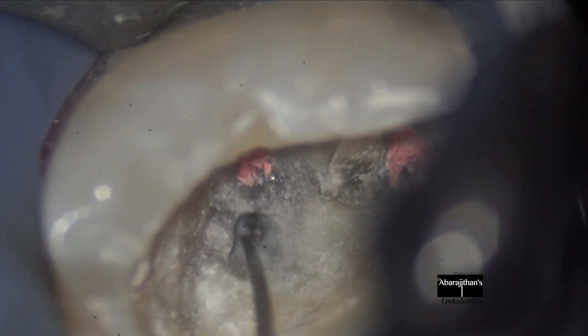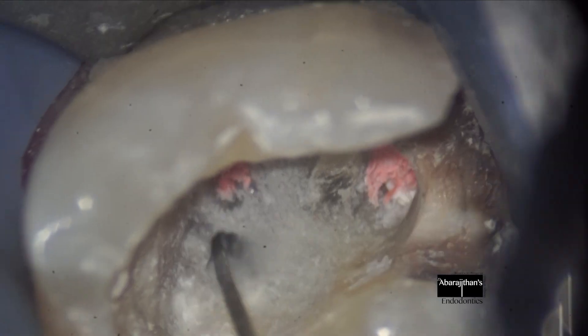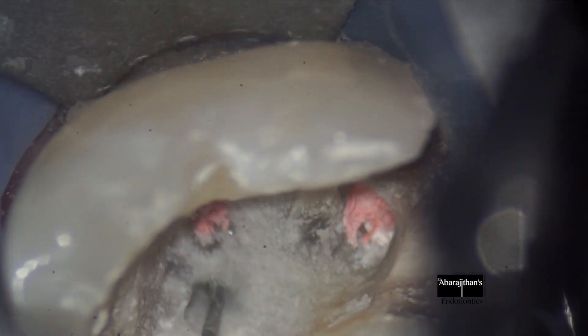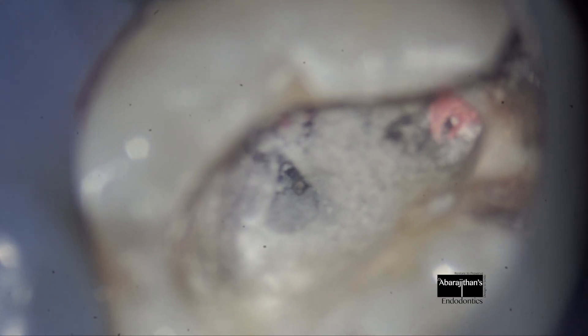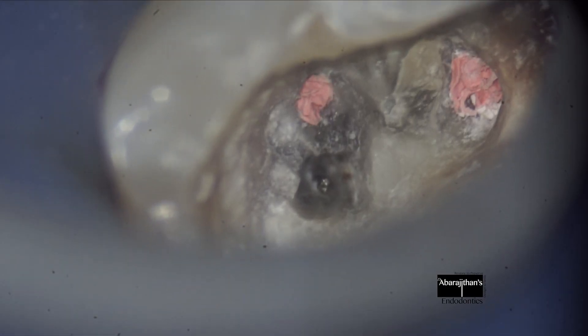Since the instrument is still not loose in the canal, I begin to do more ultrasonic troughing. Care is taken not to damage too much of radicular dentin — that should be the goal of any instrument retrieval.